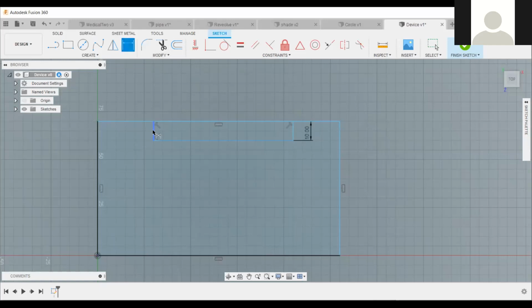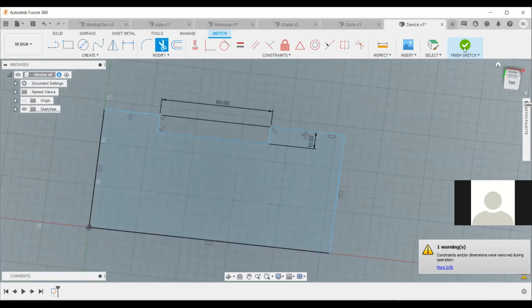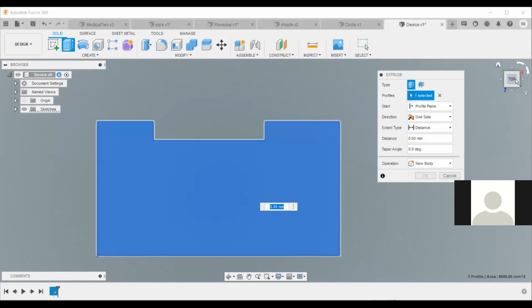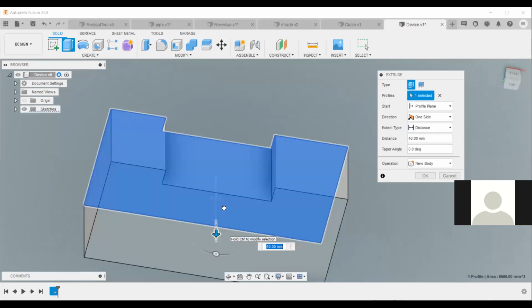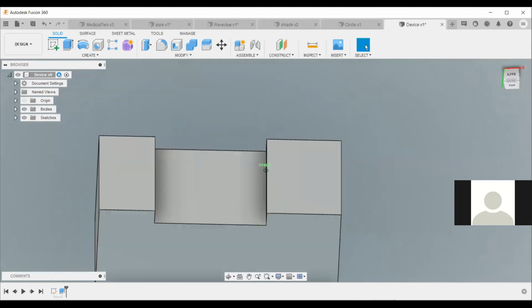Then this here to here, hapo equals 60. Then you can cut inside there. So then finish the sketch. So extrude, kila mtu sasa anafikiria anajua. Yeah, just do even 50. So it's just a part like that.